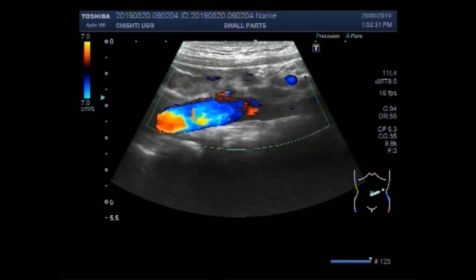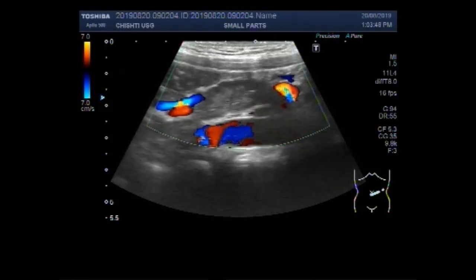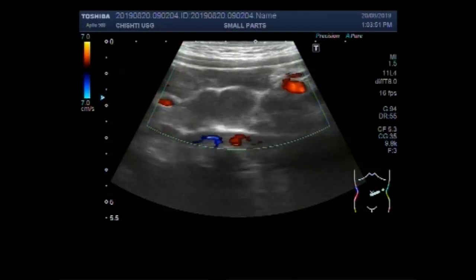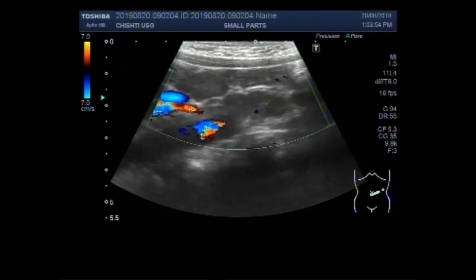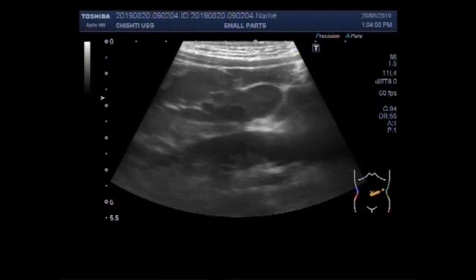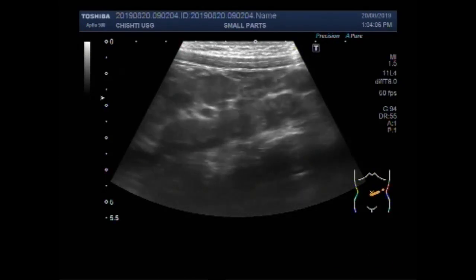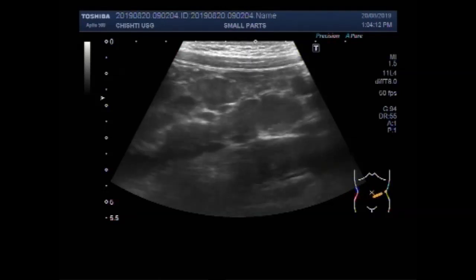This is the abdominal aorta. The lymph nodes seen on the right side are more enlarged as compared to the lymph nodes seen on the left side of the abdomen. So here there is bilateral mesenteric lymphadenitis.